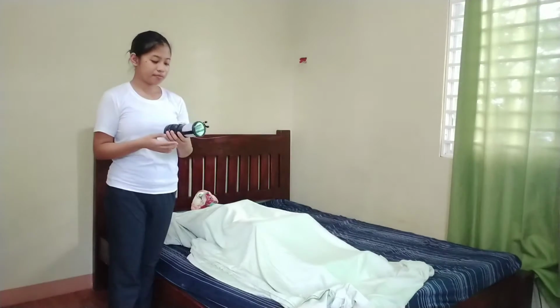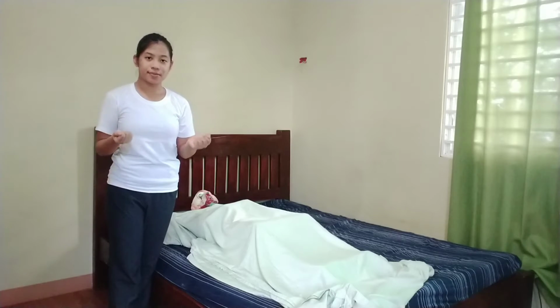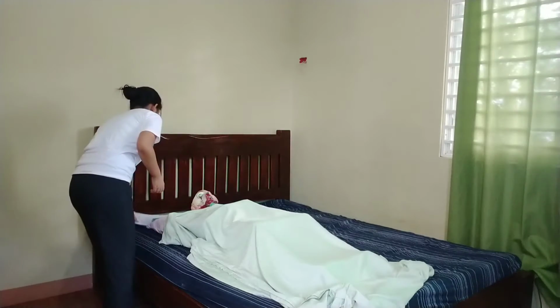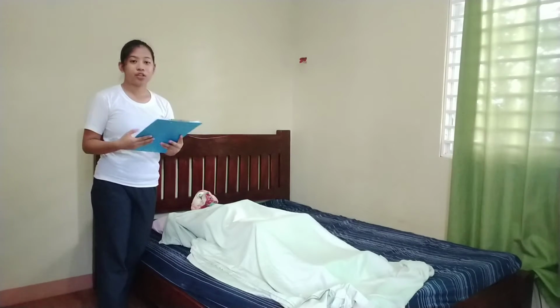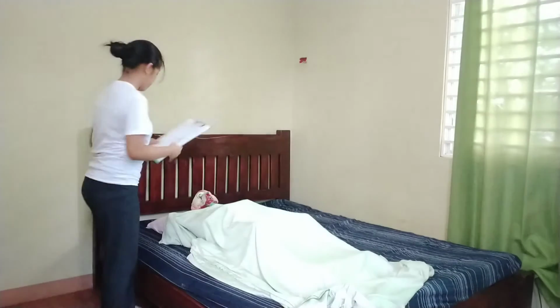So it's good. And then also, we should always remember that when touching electrical equipment, we should always have dry hands. Now, after that, I will proceed to the implementation, in which I will check the physician's order for each area to be treated and for the duration of the therapy. So let me just check the physician's order. It says here that we should use the perilite or the heat lamp for about 15 minutes to the client.